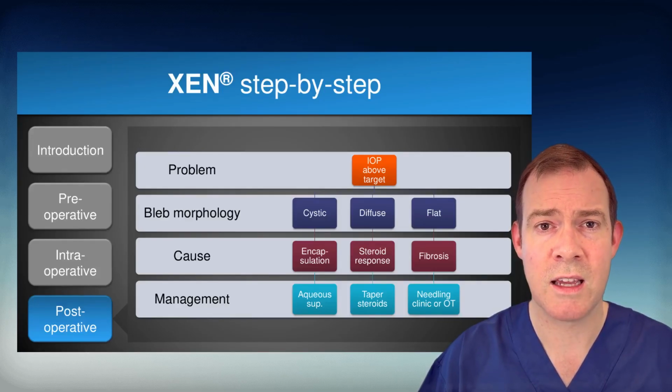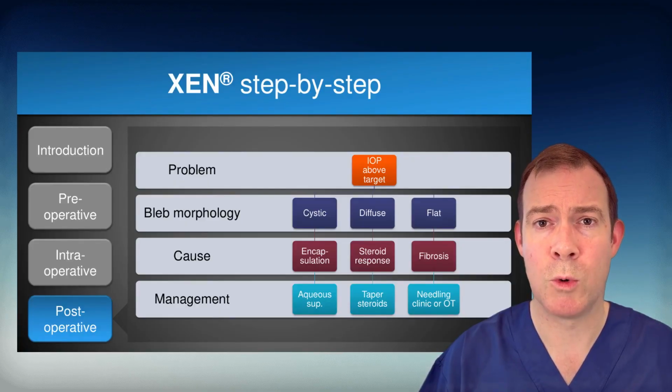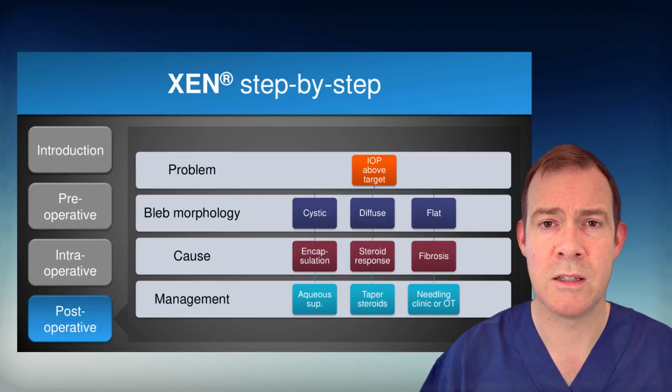If pressure is high and the bleb is diffuse, this is likely steroid response, which can certainly be seen after XEN surgery. The management is simply to taper the steroids more quickly and sometimes add in topical glaucoma medications if required.